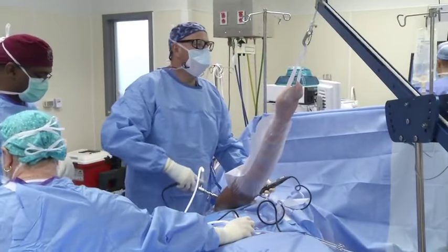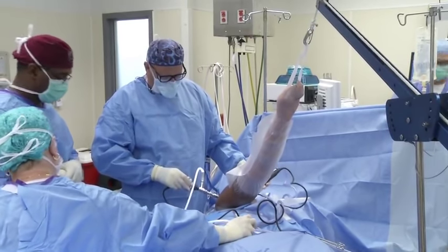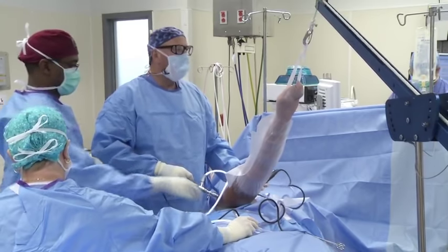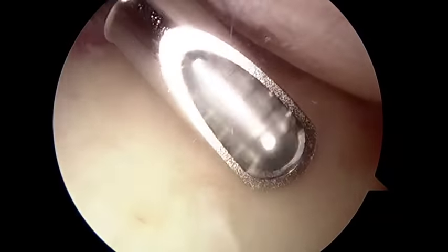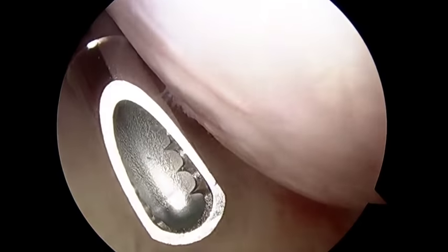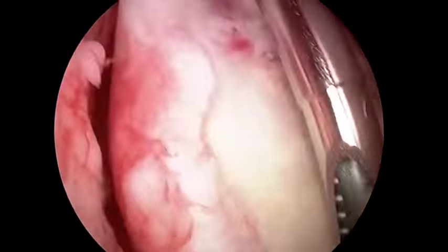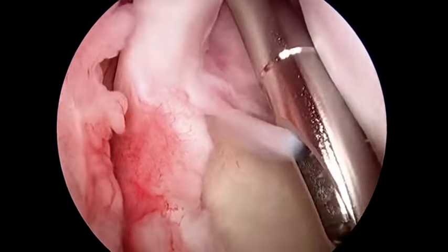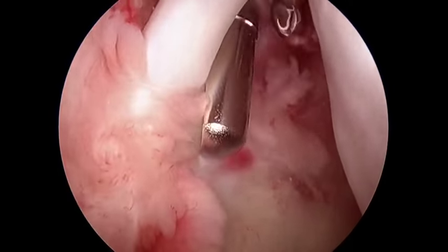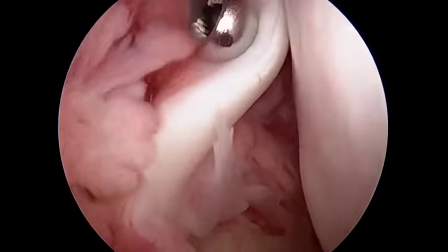So we've established two of our three portals. We've established the posterior arthroscopic portal where the arthroscope is now, and the anterior working portal where the shaver is now. And we can see that we're in the glenohumeral joint. We have the humeral head here. We have the glenoid here, which is the socket. Directly in front of us is the biceps tendon here. And that's an intra and extra articular structure.